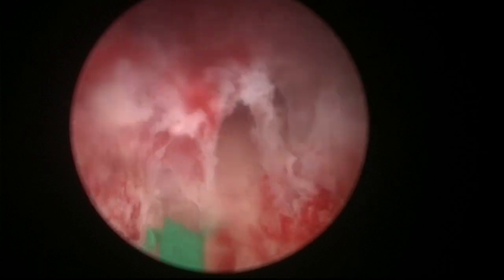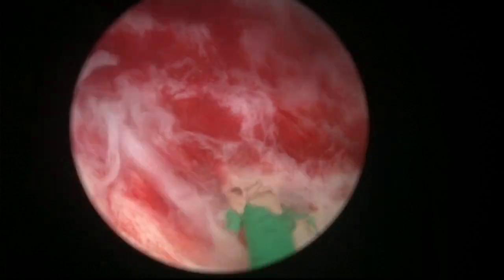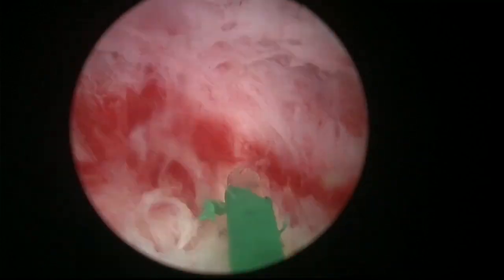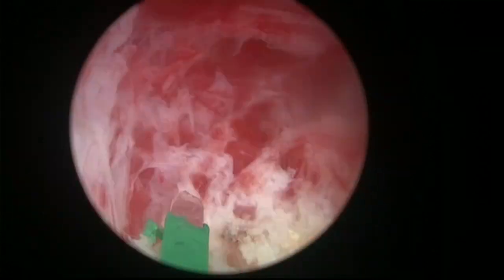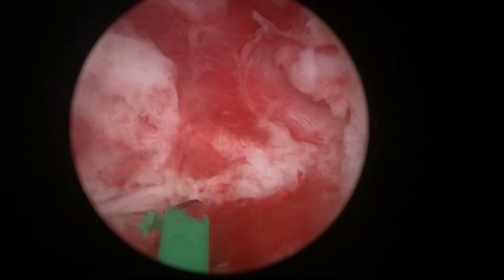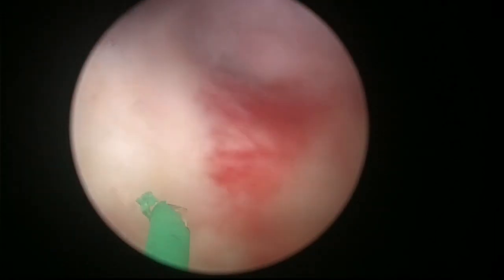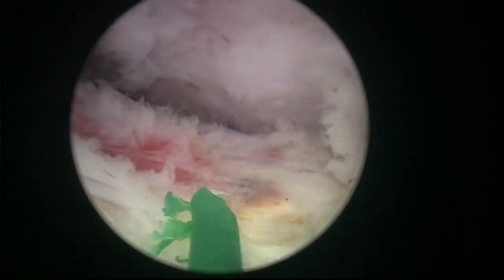Maybe I went a little bit fast, didn't pay any attention to hemostasis throughout the procedure, and now I have to spend a little bit more time doing it. So you have to find the balance between speed of dissection and quality of hemostasis, and not always do we get it right. Sometimes we go too fast. Of course, we want to go fast in the sense that we don't want to lose our time. If we can do this operation in half an hour, I think it's better for the patient. We have a shorter procedure, shorter urethral stress time.